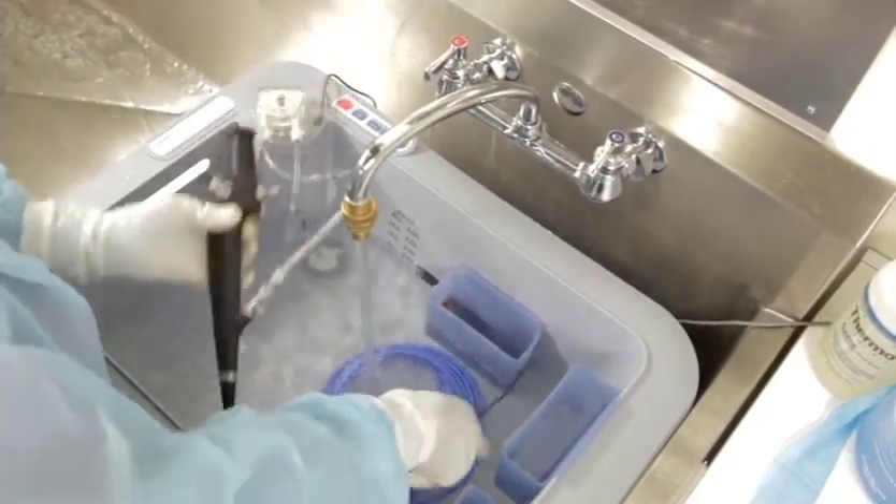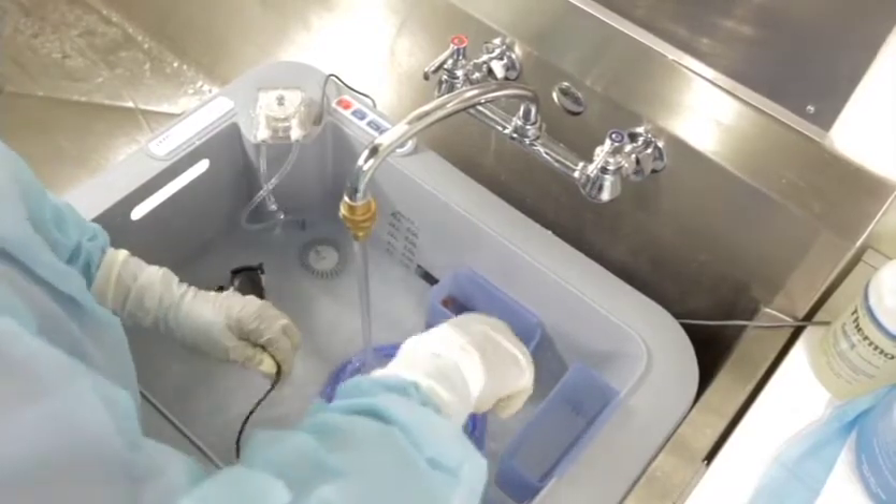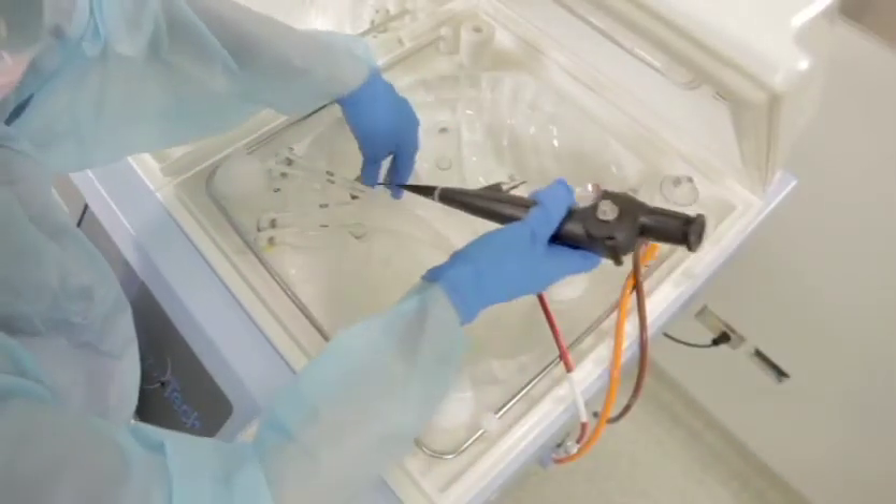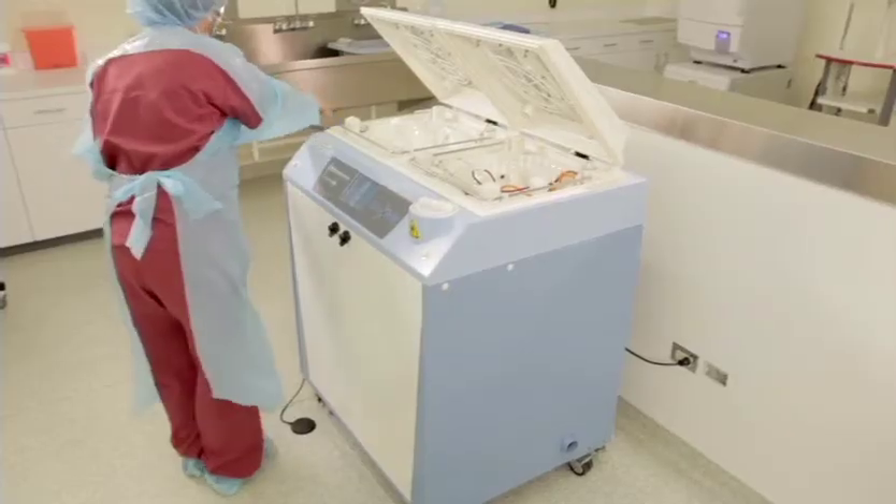Many facilities also utilize a machine to automate some of the endoscope reprocessing. A machine that assists with cleaning and reprocessing steps is clearly a step above manual cleaning alone. However, when using an automated machine, make sure you still perform the first important steps of brushing, flushing, and rinsing the channels to loosen debris before placing the scope into an automatic endoscope reprocessor.